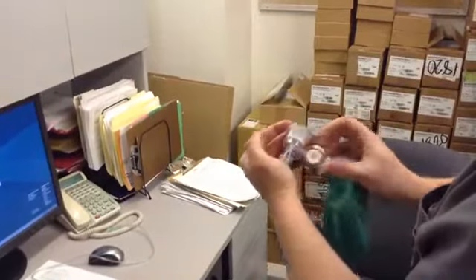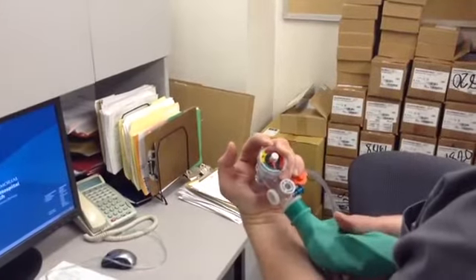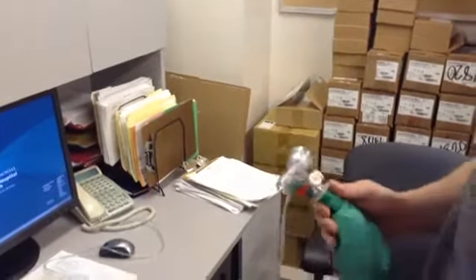So almost there, turn a little bit more, PEEP of 5, pressure of around 20. My bag is not overfilling. I'm not bagging too fast, so that's roughly about where I want it to be. Now, once you've got that, you're going to want to actually attach to a patient.